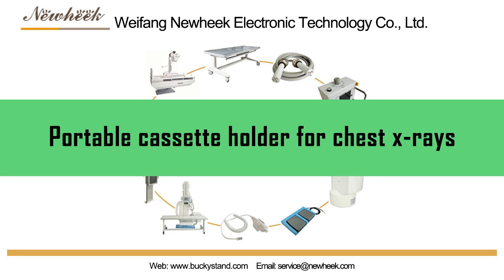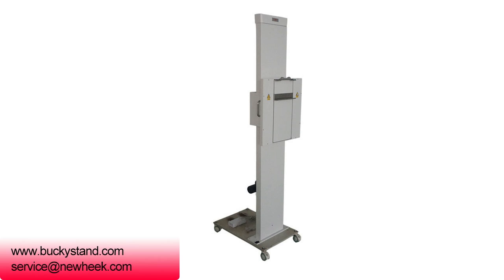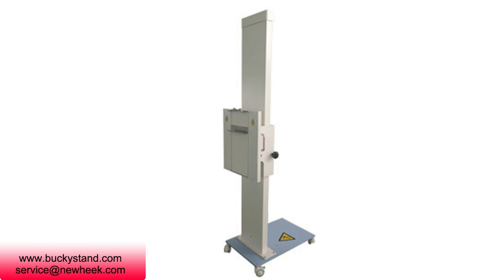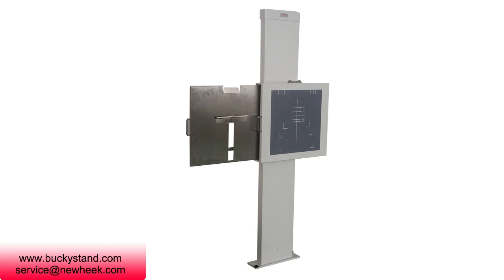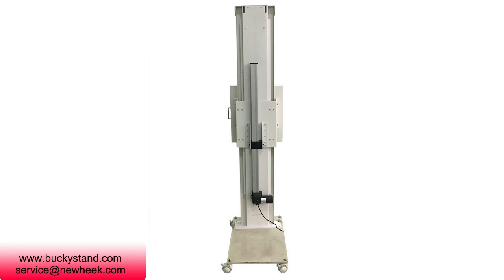The Portable Cassette Holder is a portable x-ray film cassette holder for supporting a bedridden patient in a desired position relative to the chest x-ray box. It provides a collapsible frame that angles the box to the bed such that the longest portion of the box against the patient and the frame are in parallel planes and substantially perpendicular to the x-ray beam.